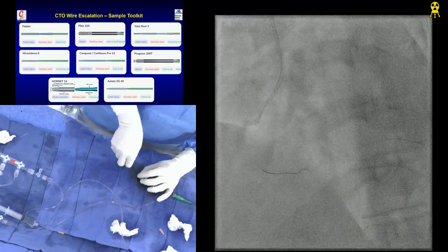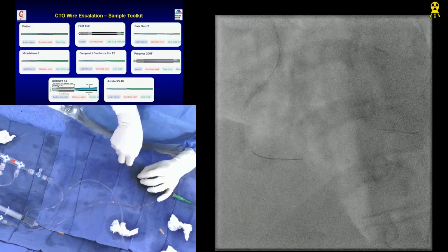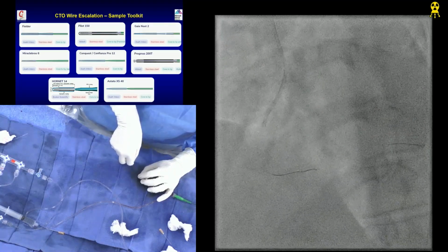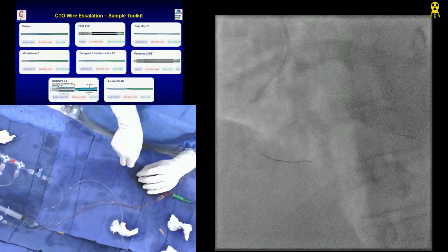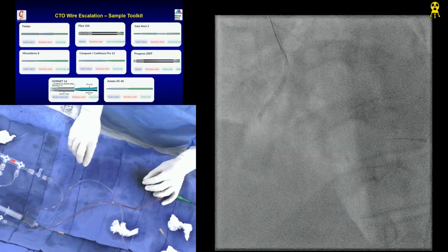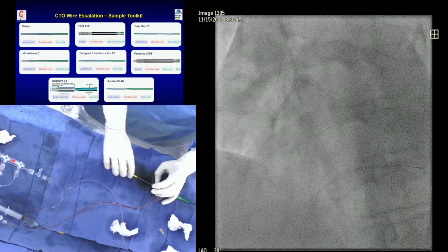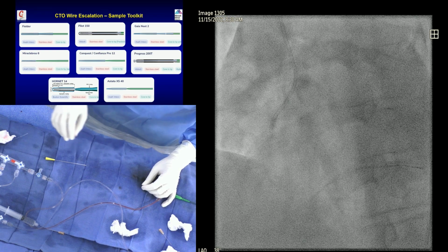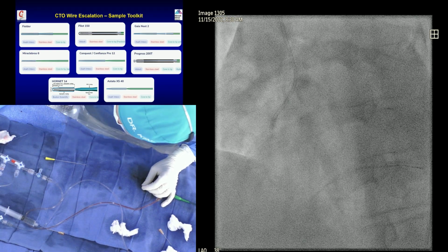This may require a little stiffer wire. Yeah. So why don't we just stent proximally? Okay, and let's take the stent first. Other wires to go here. Okay. Once we start, we may. You can leave it in the aorta, this one. Good. So what length did you take? 32? Okay. Good. So we are putting the Promus.